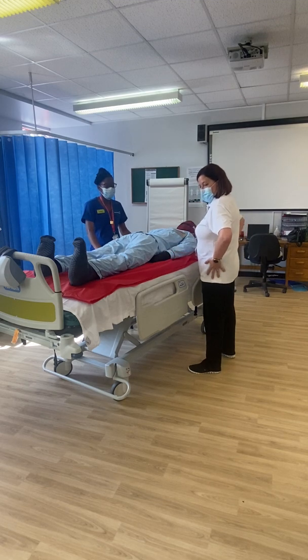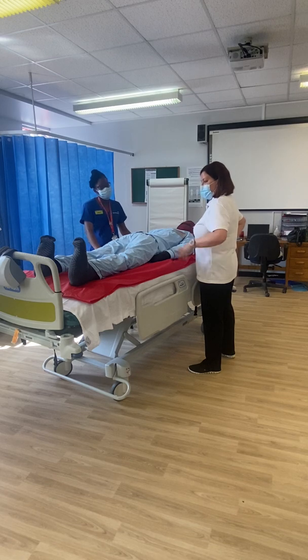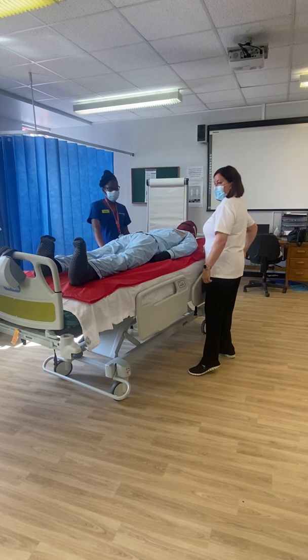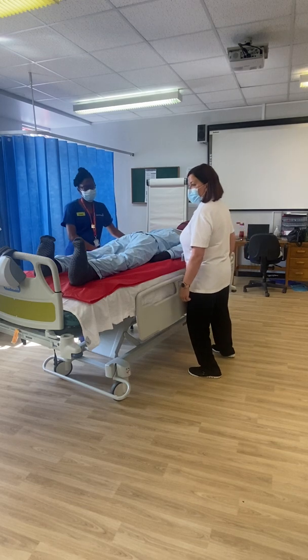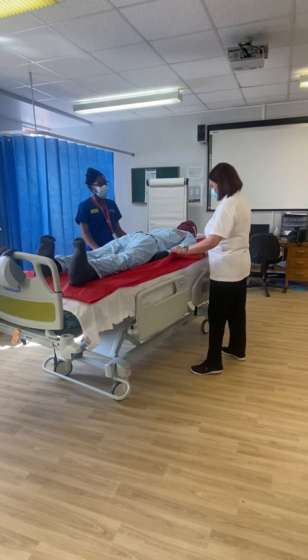We adopt a hip width, nice wide step stance, and because we're transferring the patient down the bed, we should have our weight on the head end foot. That way, when we use the commands ready, steady, slide, we're going to weight transfer downwards, and that will affect the slide down the bed.